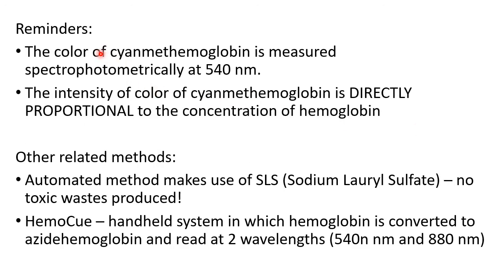Okay, the color of cyan-methemoglobin must be measured at 540 nanometers spectrophotometrically. Okay? So, ang principle behind that, the intensity of the color of cyan-methemoglobin is directly proportional to the concentration of the hemoglobin of the patient. So, meron tayong further improvement pa.